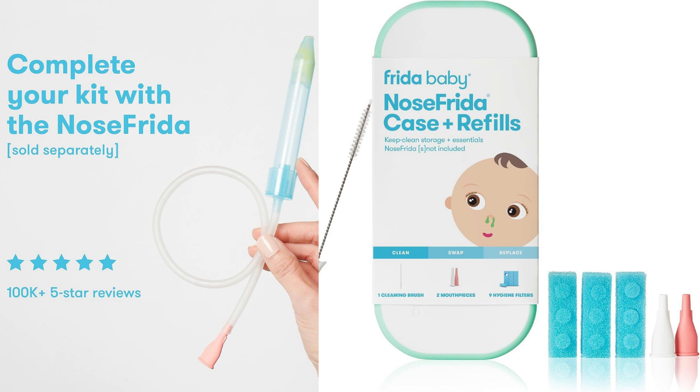The case itself is compact and well-designed. It's made of durable plastic and has a secure closure, ensuring that the Nose Frida and its components are protected when not in use. The case is also travel-friendly, allowing you to easily carry the Nose Frida and its accessories while on the go. The size is just right — not too bulky, and fits well in a diaper bag or purse.